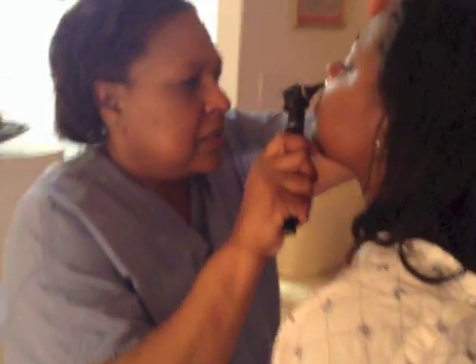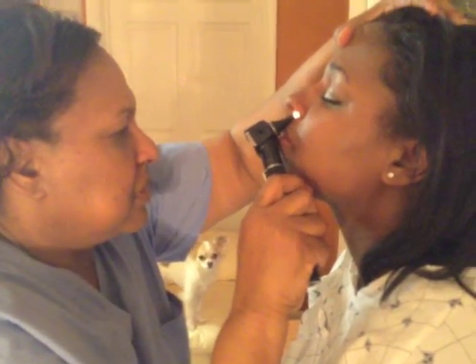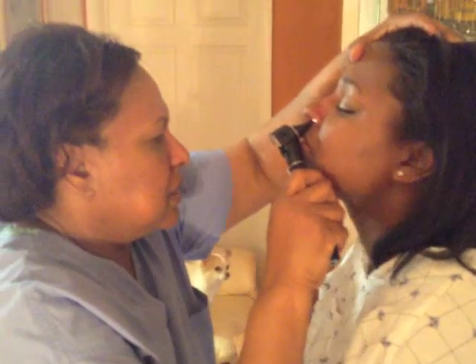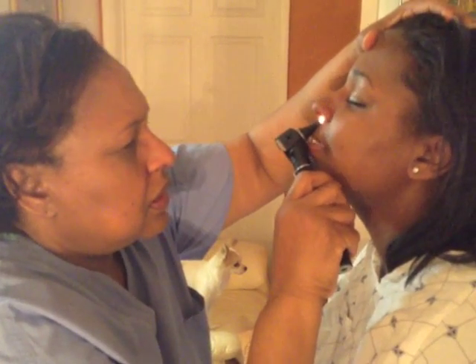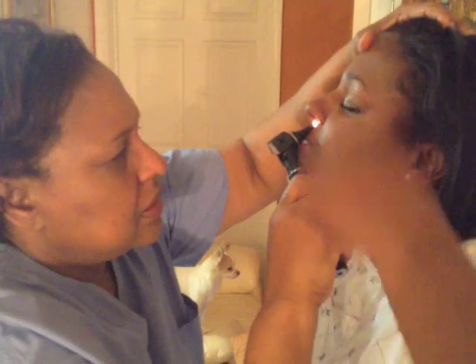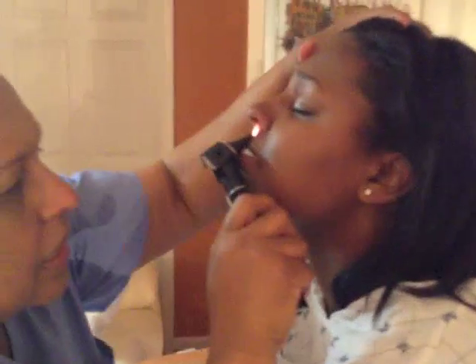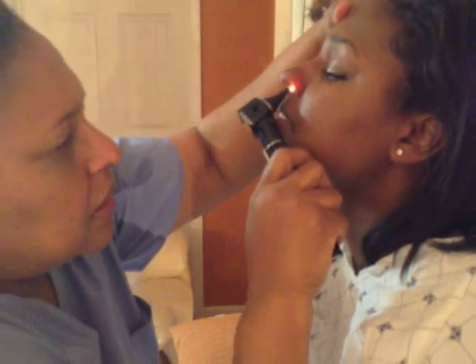As I'm looking into your nostrils, I don't want to put the speculum right into your nostril because your septum is sensitive. So I can see your nasal septum. I can see your turbinates. They look good. They look even. I'll move downwards, and it looks good. Thank you. And I will do the same thing on the other side.